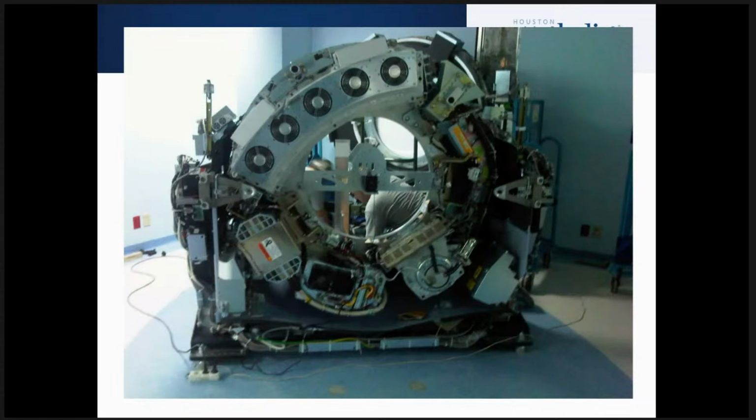ring of detectors that are completely around the patient, and we call it a ring, in contrast to what we see with SPECT imaging, where we are only covering the front of the patient.